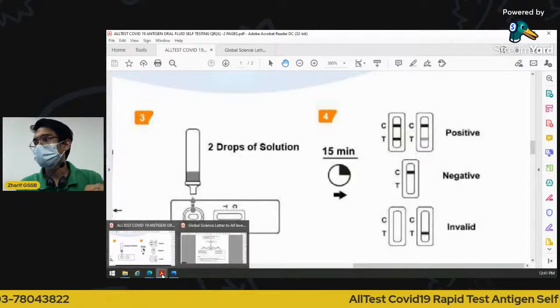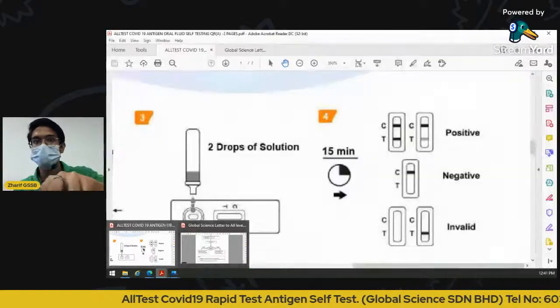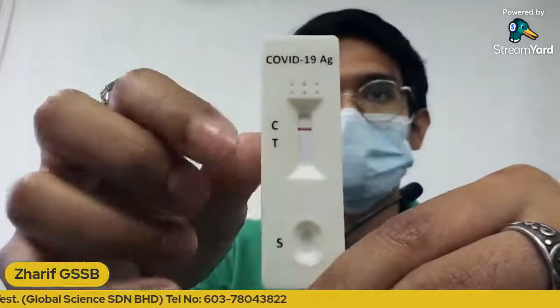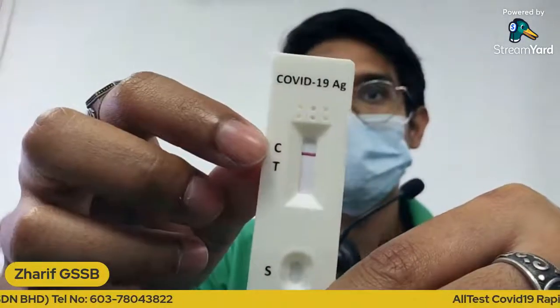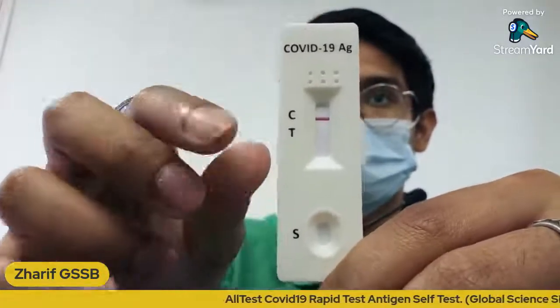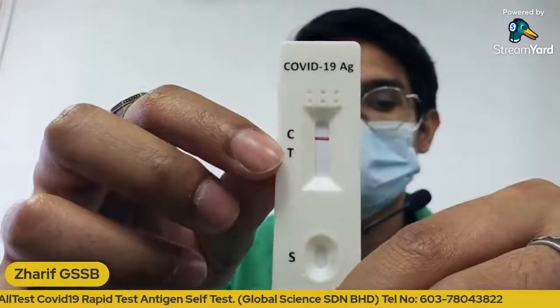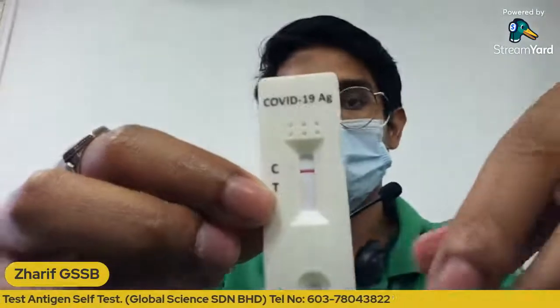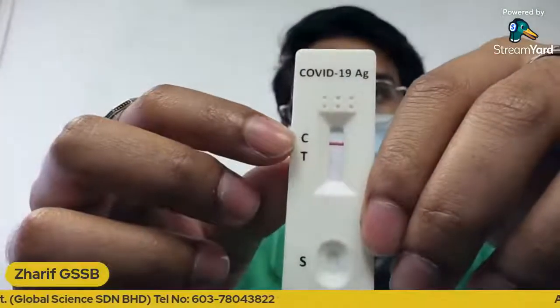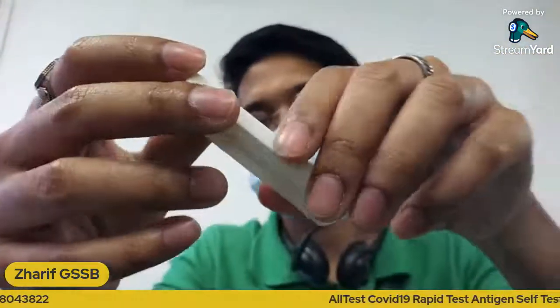And then we will progress. So for an example, this is what the result would look like if it's a negative. As you can see, there is a visible red line at C but no line at all at T. This is a negative test result. So if there's another line appears at the T, it's a positive, therefore you are positive for COVID. But if there's no line at all at the C, then it is an invalid.